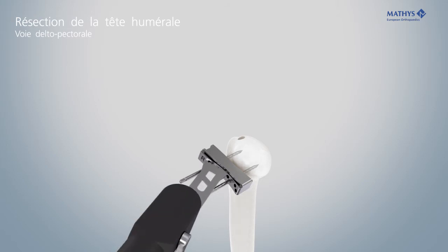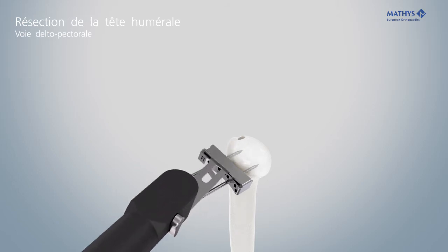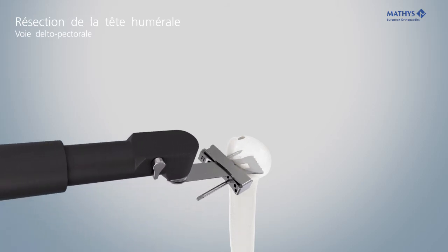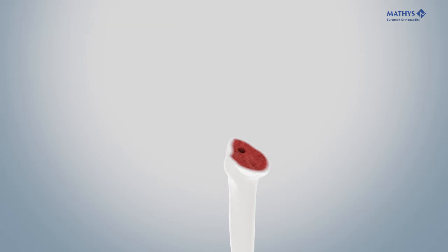Resect the humeral head through the slot of the cutting block. If re-resection should be necessary, transfer the cutting block onto the pins via the proximal holes and saw again. Remove all instruments and check the height of the humeral cut.